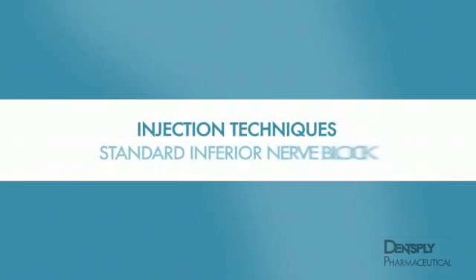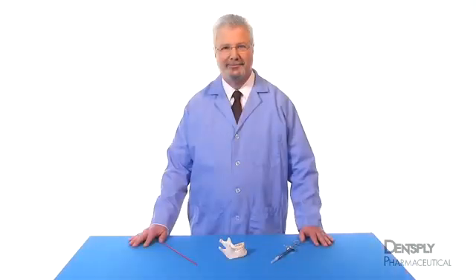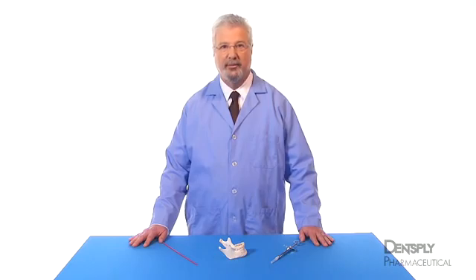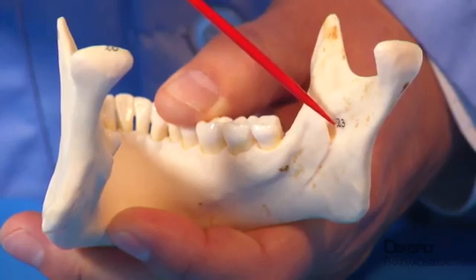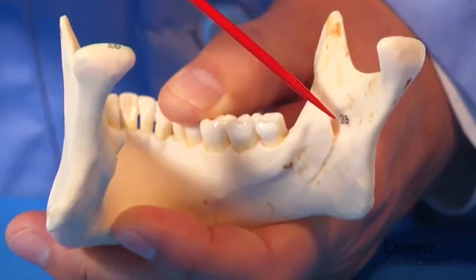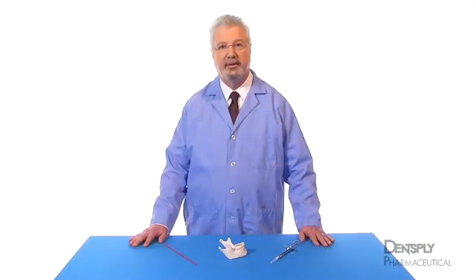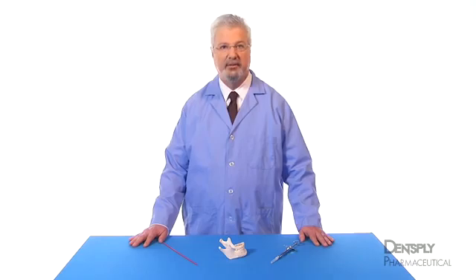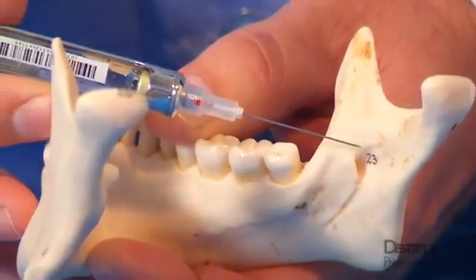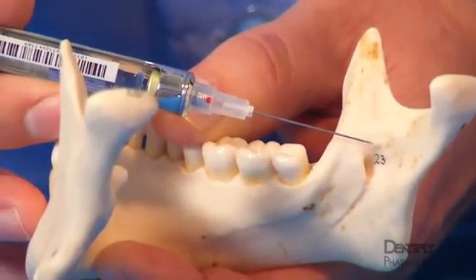Injection Techniques Part 1. A standard or classical inferior alveolar nerve block is used worldwide for producing mandibular anesthesia. The target for the inferior alveolar nerve block is the mandibular sulcus, just superior to the mandibular foramen and behind the lingula, a bony prominence on the ramus that anchors the anterior attachment of the sphenomandibular ligament. Deposition of anesthetic in this region will bathe the inferior alveolar nerve just before it enters the mandibular foramen.